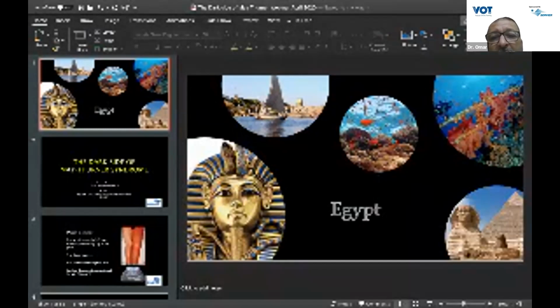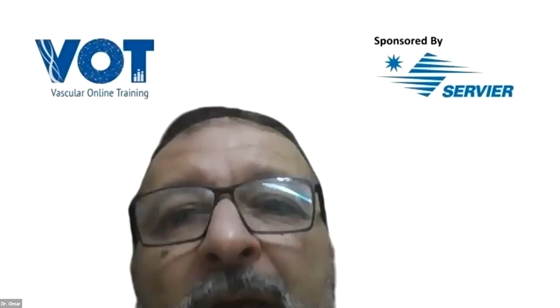Okay. Another question to Professor Lowell Kabnik. In case of venous anomaly, do you prefer duplex scan or CTV, and why? It's a bit of a tricky question. I like both. It's very helpful to look at a duplex to see if there's arterial as well as venous contribution. And then it's also nice to see the anatomical landmarks with the CT scan. So I tend to use both.